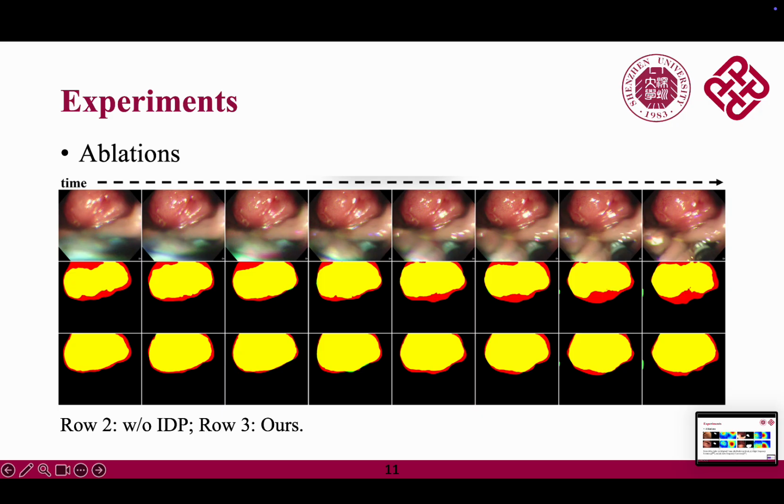The key idea is to improve segmentation from both the intra-frame and inter-frame perspectives. On the one hand, HWFA enhances intra-frame discriminative features through hierarchical frequency domain modeling, which helps the model better segment highly camouflaged polyps. On the other hand, IDP captures temporal divergence across adjacent frames, which improves tracking stability and reduces temporal inconsistency. Extensive experiments on SunSeg and CVC 612 demonstrate that our method achieves state-of-the-art performance while maintaining a strong balance between accuracy and efficiency.